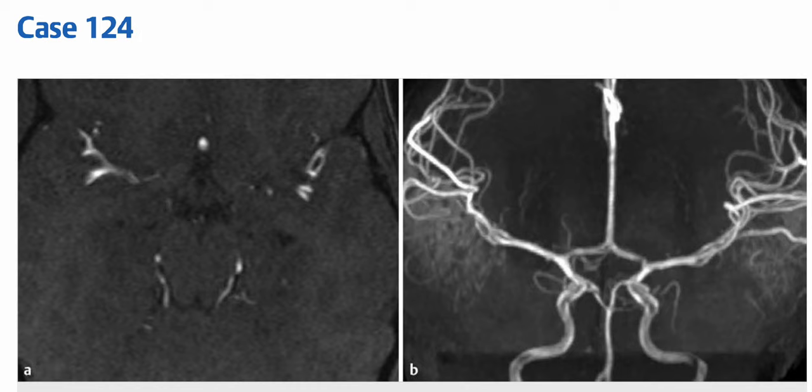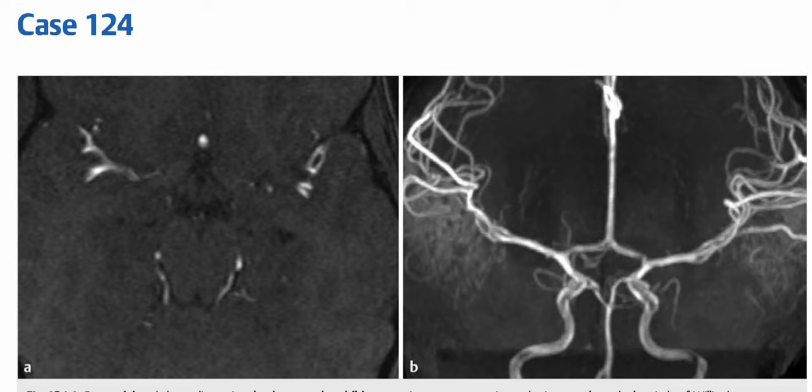So the key finding here is of a solitary vertical A2 segment of the anterior cerebral artery, and this is a diagnosed case of azygous anterior cerebral artery. So this is a case of azygous anterior cerebral artery.